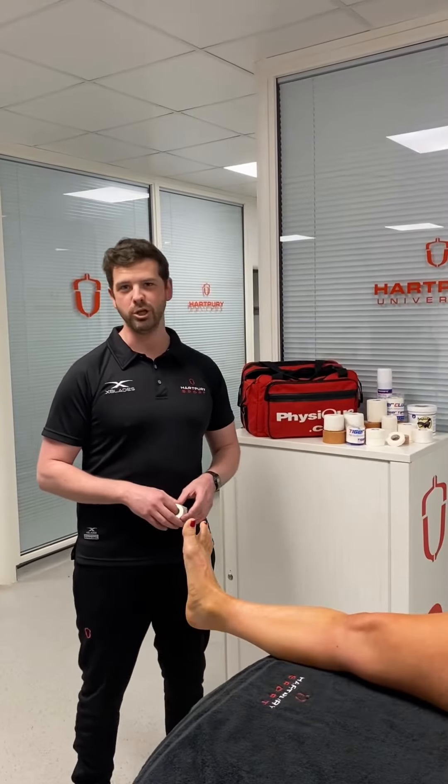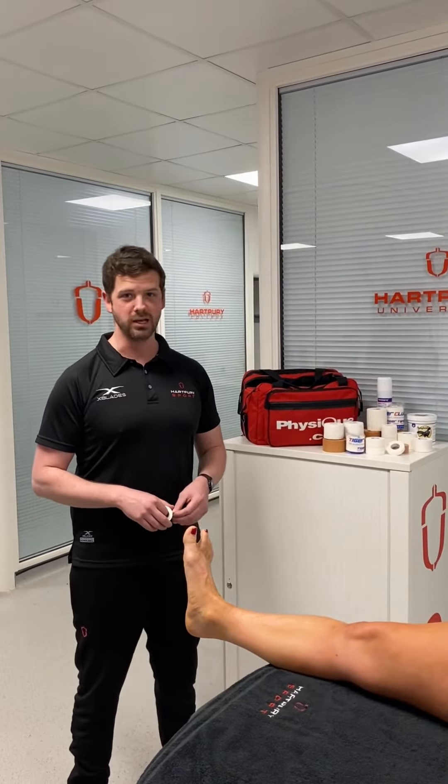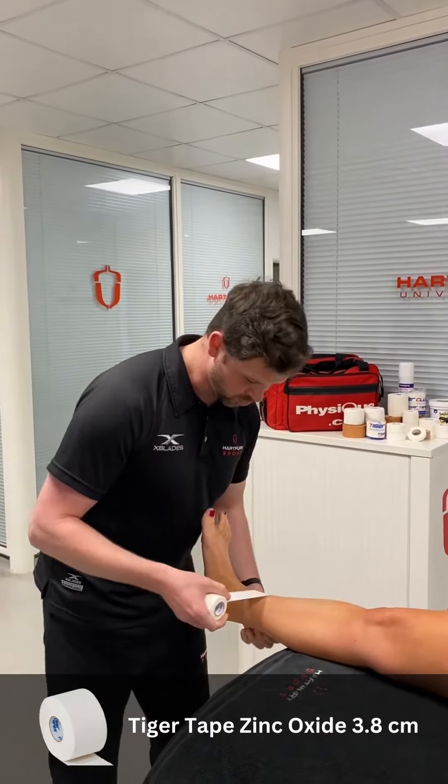Hi, I'm Joe, I'm from Hartpury University and College and today I'm going to go over some ankle taping techniques. I'm going to use a Zinc Oxide 3.8. I'm going to start with an anchor.